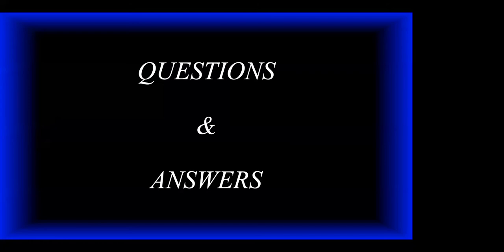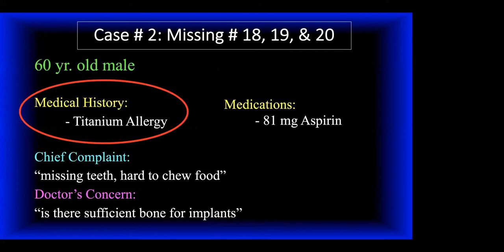Okay, so our first case is done. Do we have any questions on that first case? We'll answer a couple right now before we go to the second case. Robert, do we have anyone? Nope. We have no questions. Okay, we'll do those at the end then. Okay, let's go to the second case.